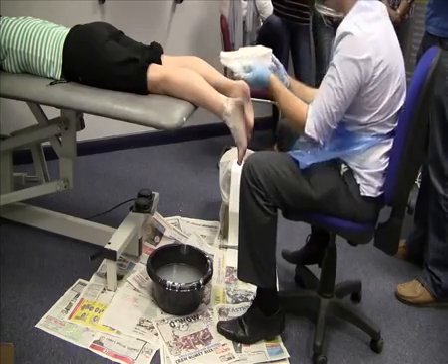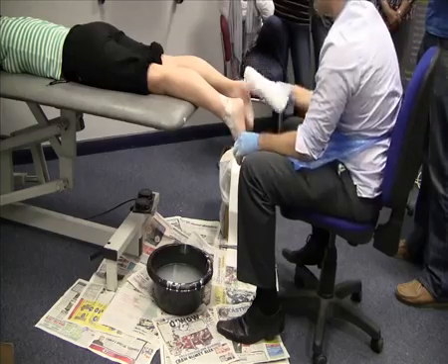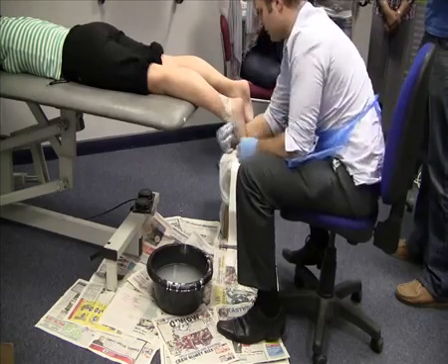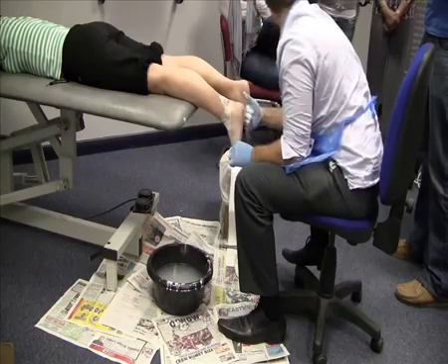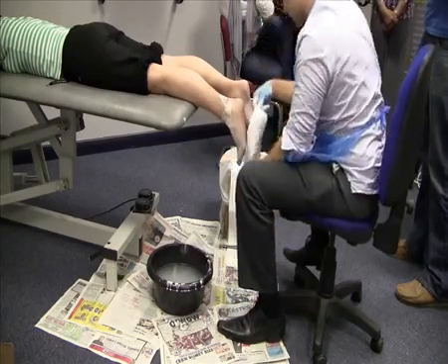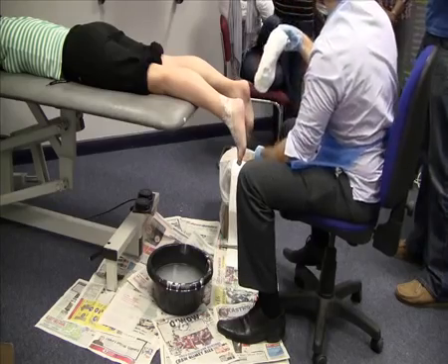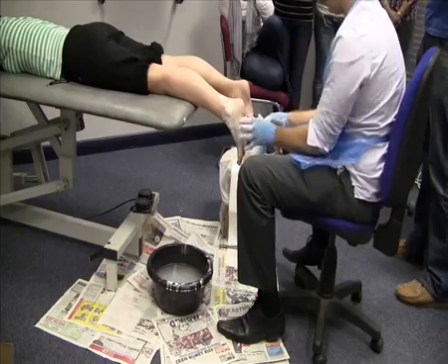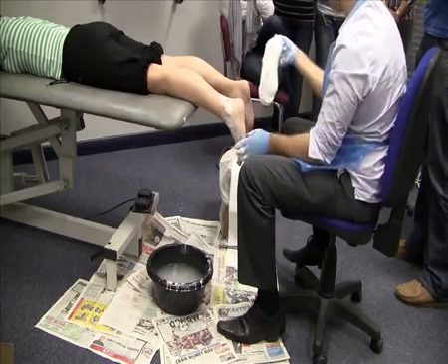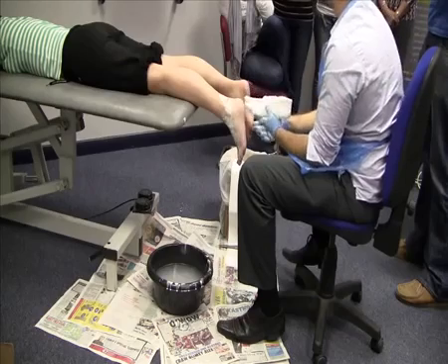Always check after doing the cast that the cast represents the foot. So you might want to put the foot again in neutral, have a look down, see what the forefoot to rearfoot relationship's like, then have a look at your cast and see if that's reflected in the cast. Because you're dorsiflexing and putting pressure on the foot, what you don't want to do is either evert or invert the foot and distort the cast. But that's Plaster of Paris casting.